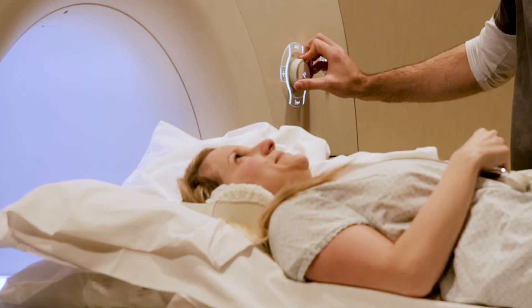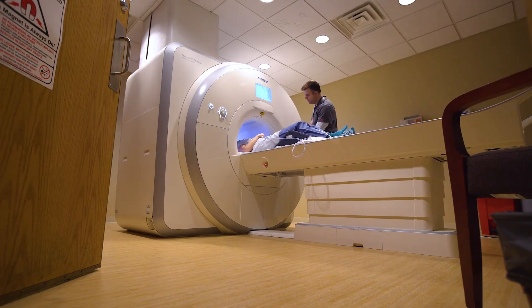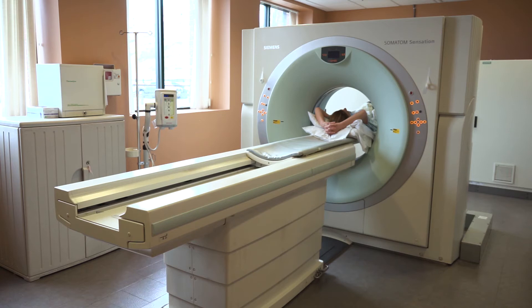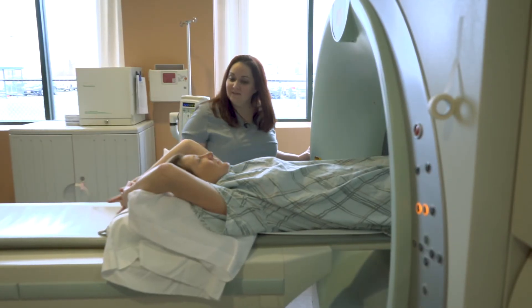Depending on your exam, you may need more imaging after fluoroscopy, which could be an MRI or CT to help you get the answers you need. Ultimately, I was happy I knew about CDI, because you're not going to get answers without imaging — and the imaging leads to the problem, which leads then to a solution.